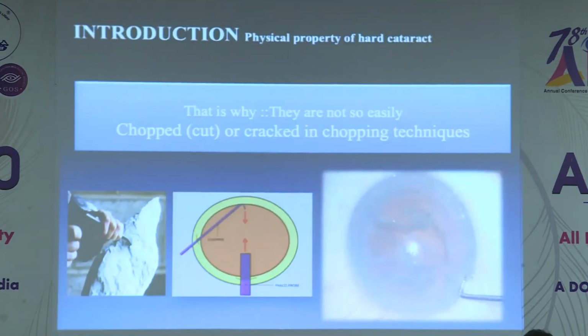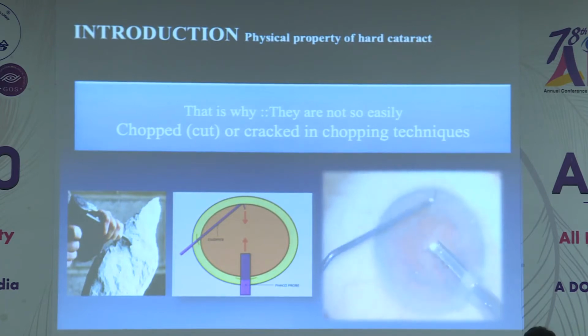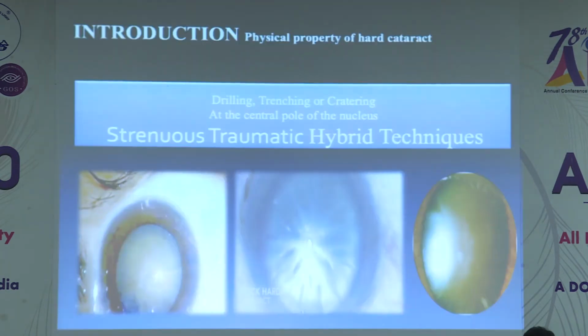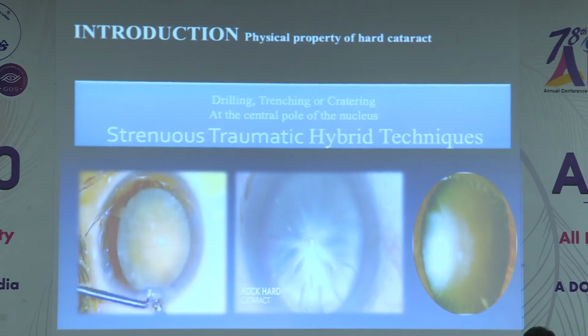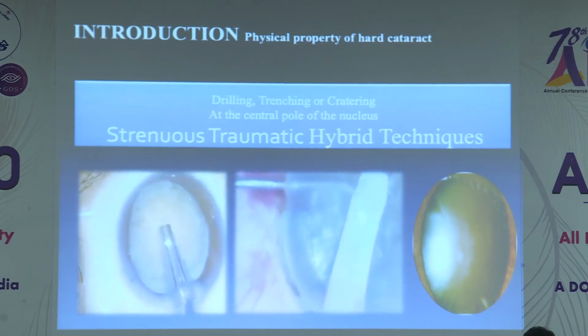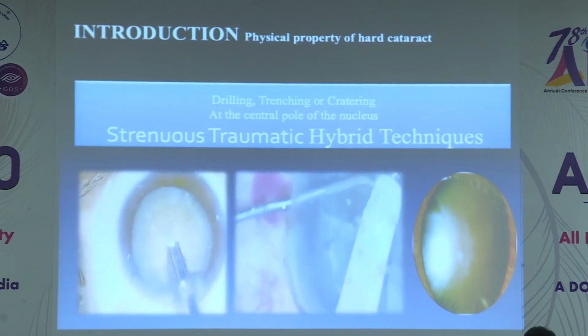And the techniques we use, I'll show you, this is the horizontal chop we do in most cases. In horizontal chop, if you have a grade 2 or grade 3 nucleus, you can crack it very easily. But if it's harder than that, then you don't manage to split the nucleus properly, because the nucleus is so hard at the center, and you have to bring the chopper to cut the nucleus and then divide it at the center, which many times doesn't happen. Then we have to opt for more hybrid techniques. Hybrid technique, you all know: you have to do trenching, divide and conquer.